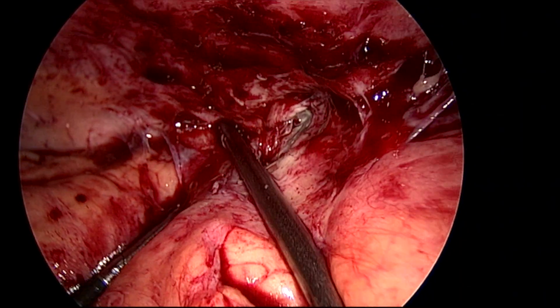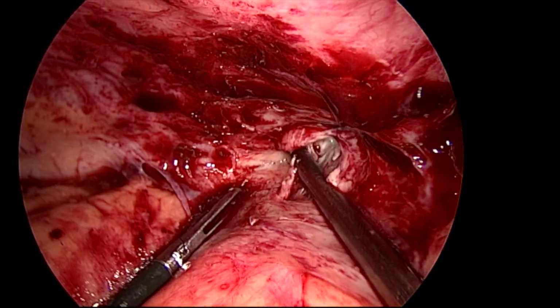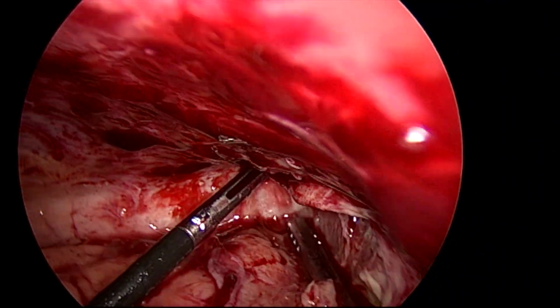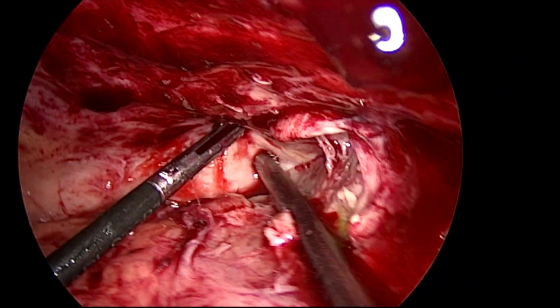So I'm doing it very carefully. I can confirm the structure, then only can I separate or divide. So I'm slowly using the suction nozzle. It is like a finger, like my finger in open surgery. I was able to separate the omentum from the liver.